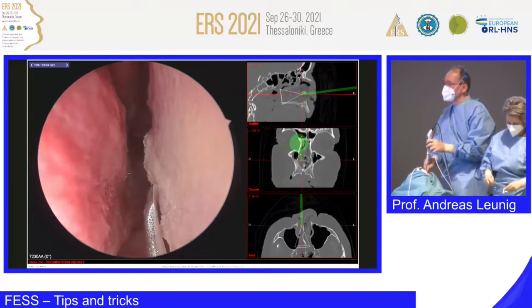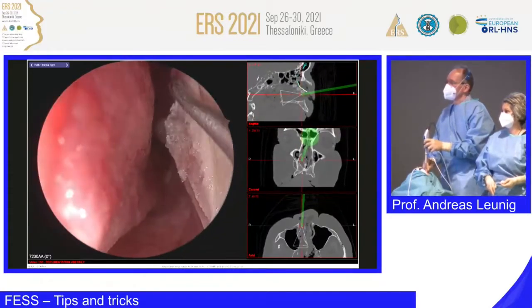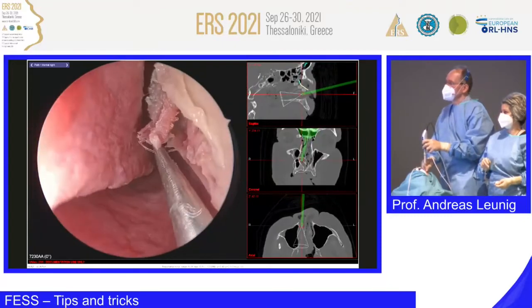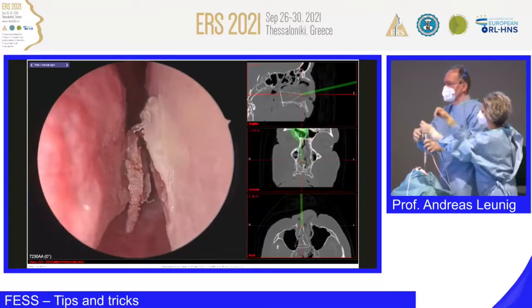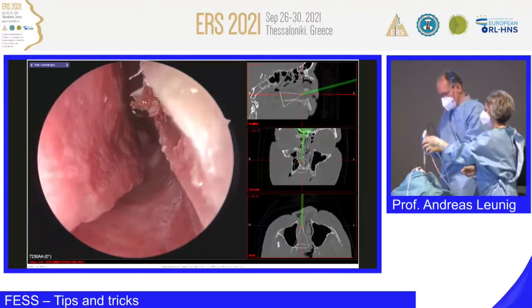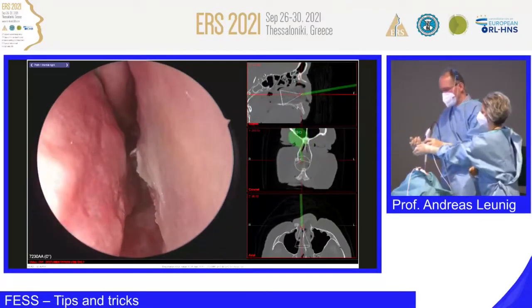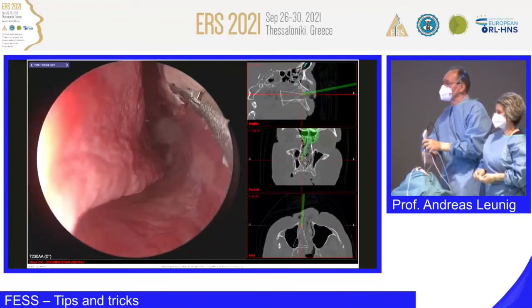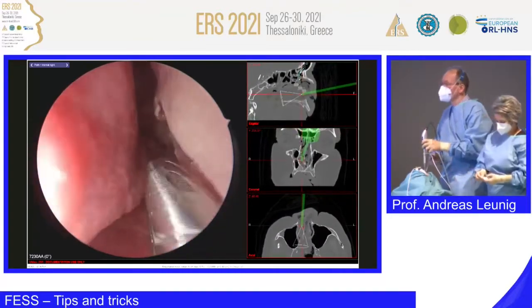And even this space here would give the patient more space for breathing. You could as well go here and crack, perforate the bone like this here. Oops. And pay attention not perforating. Sometimes it happens, but you know, usually it's not a problem. Okay, so now Blakesley. And the patient doesn't really feel that there was a lot of surgery done at the septum. So, going in here, oops, taking this out. Very gently, always look how you take out the bone, because otherwise you can make some slight injury or cut to the mucosa. Now I try to remove this as well. Good.